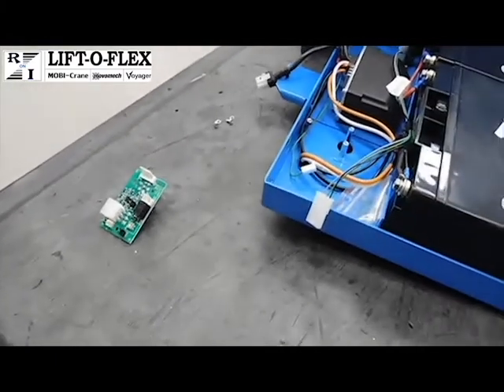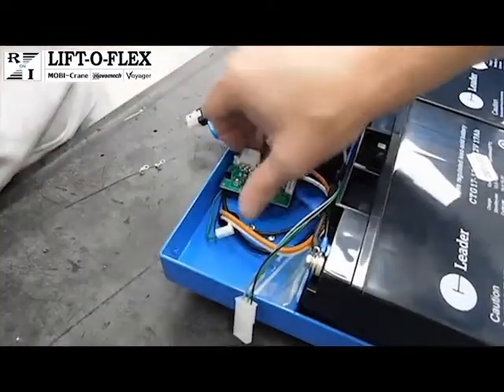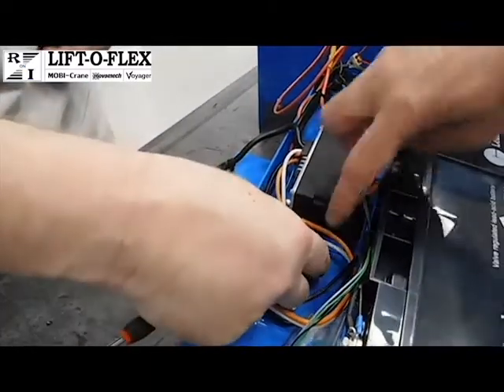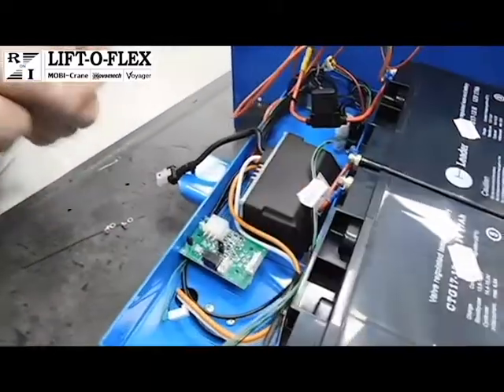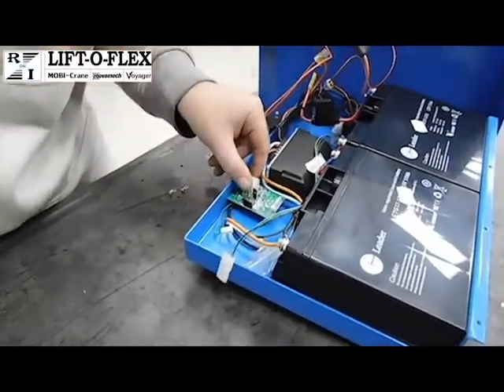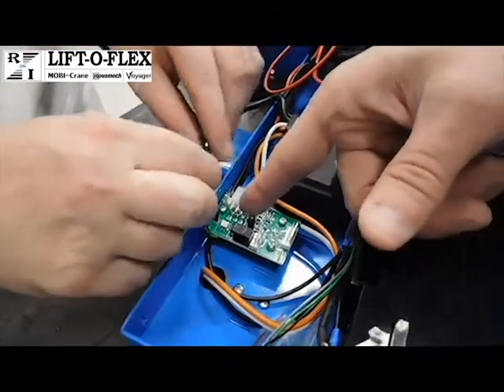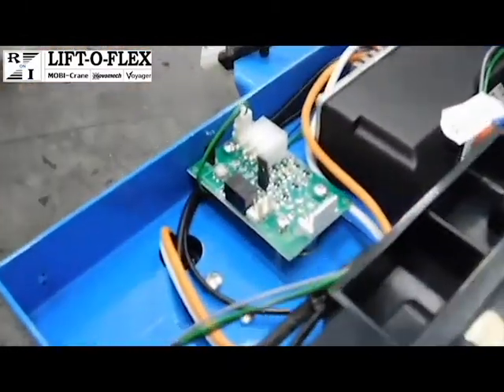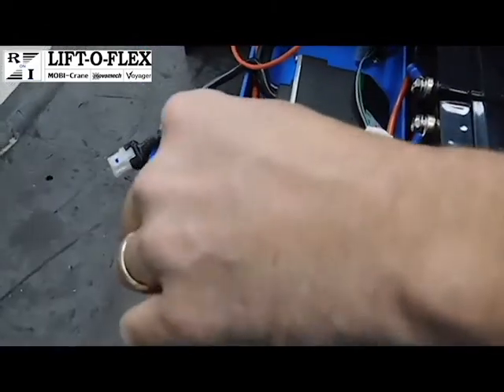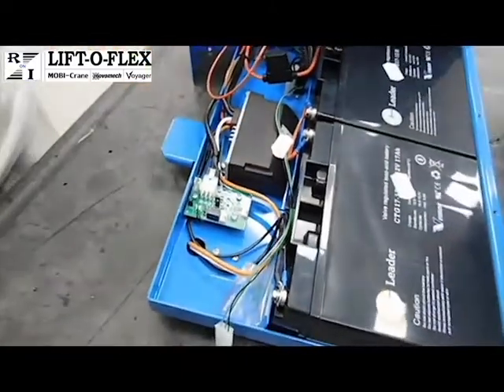So for replacing the card, you would reverse the operation. Place the card so that the hand pendant plug-in matches up with the hole. Be sure all the wires are clear of the card. The small white connector is placed back on the board on the area that's labeled P1. It is directional, so it can only be inserted one way. And then reattaching the Molex connector, which can also only be put on one way.